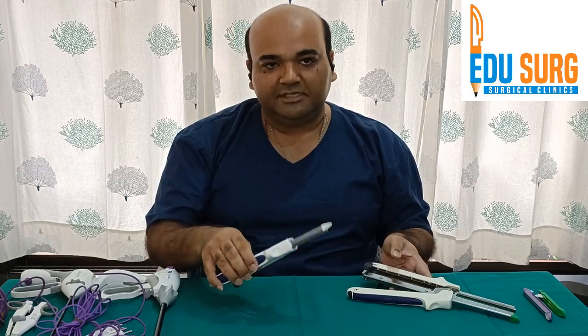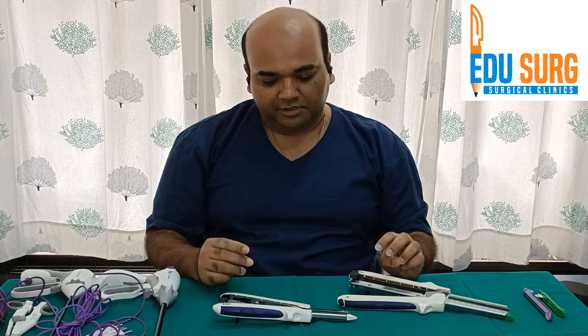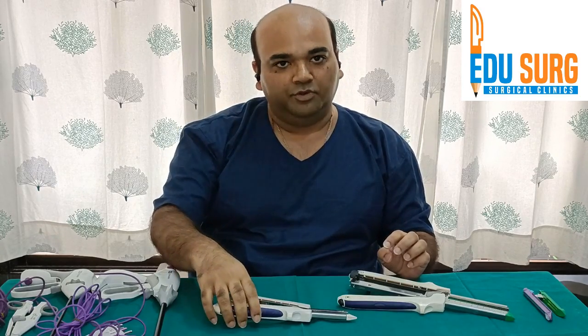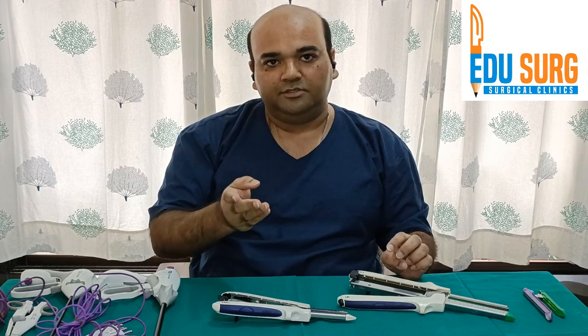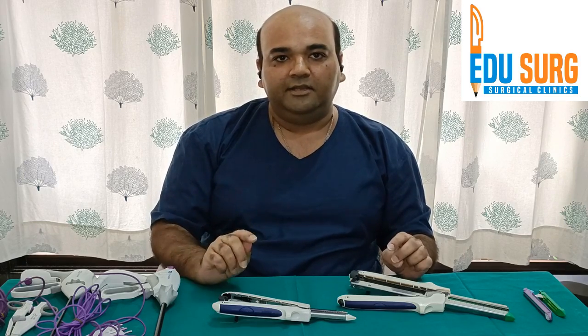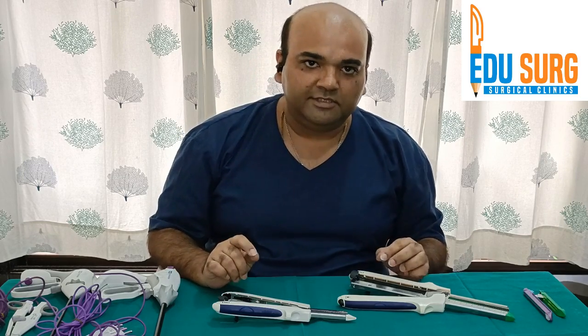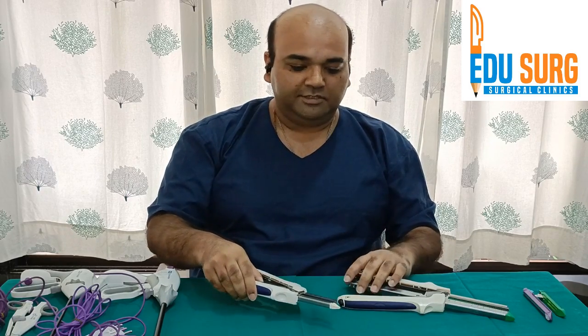These staplers are used for intestinal anastomosis — side to side or end to side — whichever anastomosis you want to do for small bowel, large intestine, small intestine to stomach as well as colon. The low rectal and anal anastomosis are done by circular stapler, which we will see in the other parts of this video series.